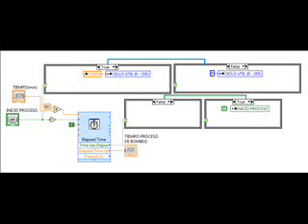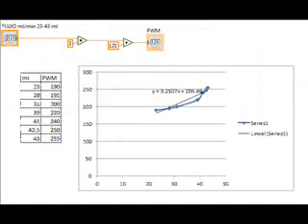Our infusion pump is controlled with a DC motor of 15 volts, which is controlled with PWM. In this way, we control the speed of our motor, and therefore we control the volume of the solution. To define the range of the volume, we characterized the volume that the motor was able to pump with each PWM signal. So, for a PWM of 190, we obtain 23 milliliters, and for a PWM of 255, we had 43 milliliters. We generated with Excel an equation that could calculate the correct PWM for a volume defined by the user between 23 and 43 milliliters.